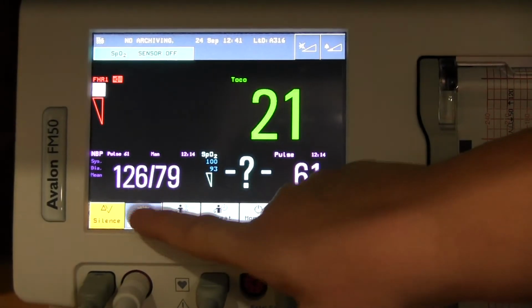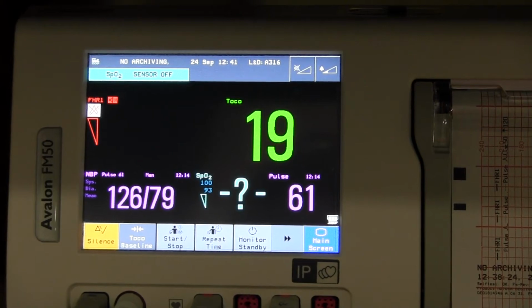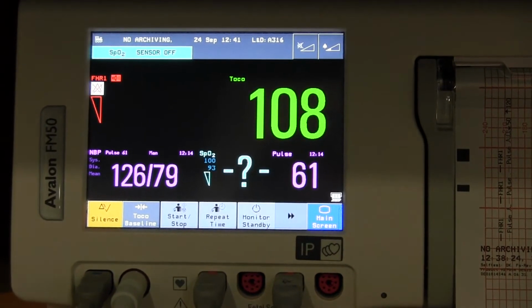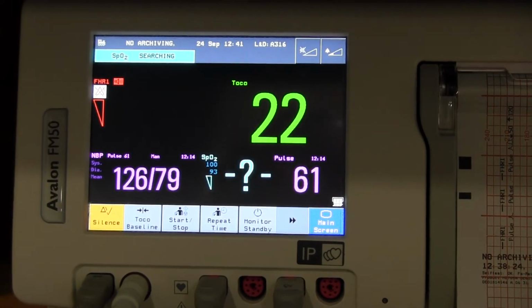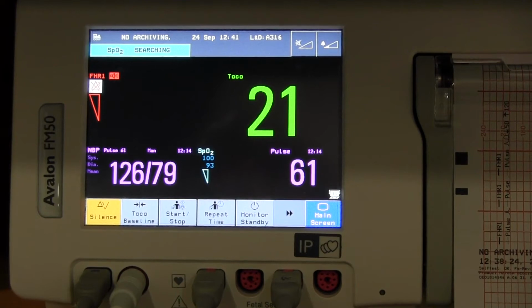The maternal pulse displays when using the TOCO transducer, unless you are already using the maternal pulse ox. Perform a manual check of the maternal pulse to determine that it is consistent with the tracing when you are monitoring a real patient.